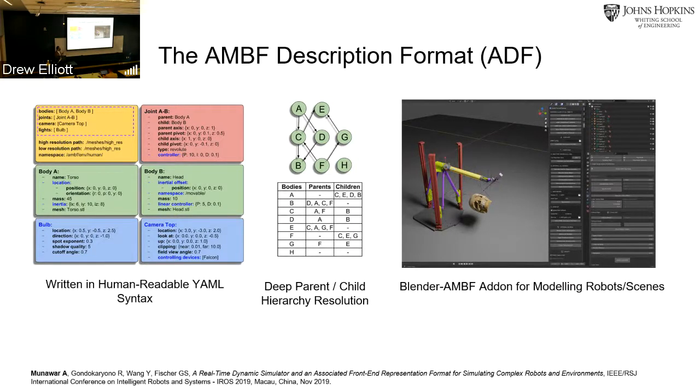What it will essentially give you is that every body that's higher up in the chain will have access to all the lower bodies. So by getting a handle to a base body, you can control all the joints. And that's very useful when you're trying to control the robot through an external node, and you only want to control up to a certain joint, and then take the handle of the body afterwards, and then control all the joints in order. And we use that a lot.